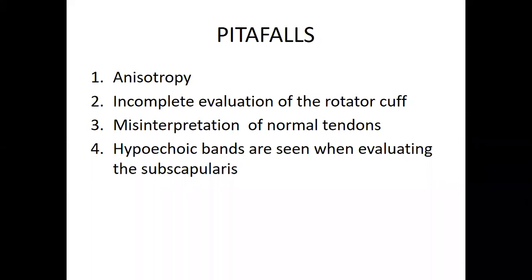Sometimes these structures may be confusing because you don't know exactly what you are looking for. You don't know exactly how a tendon will be differentiated from a muscle. But the key issue is to know your anatomy and the appearance of specific structures on ultrasound.